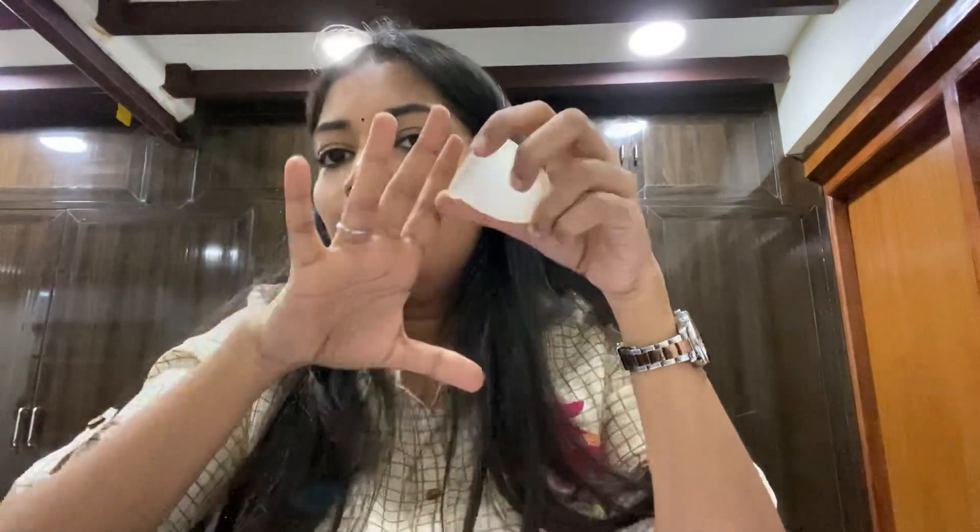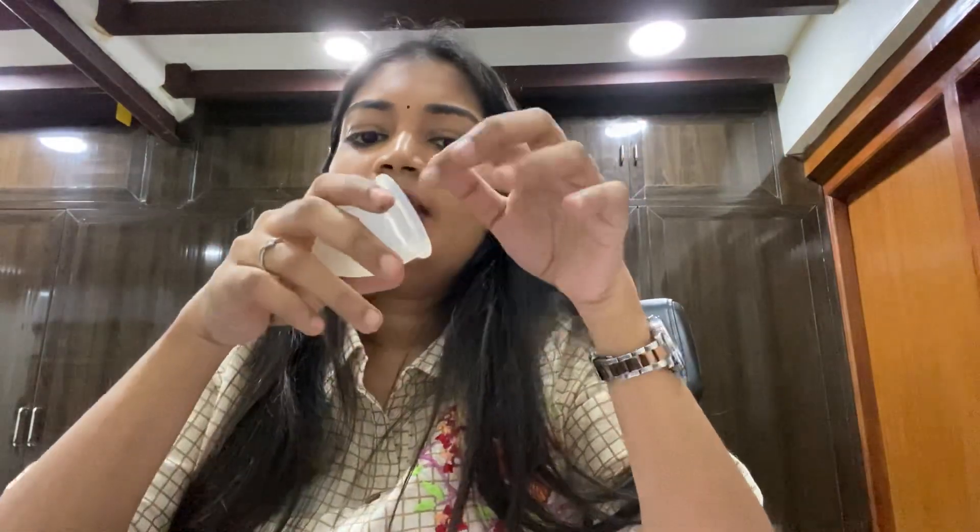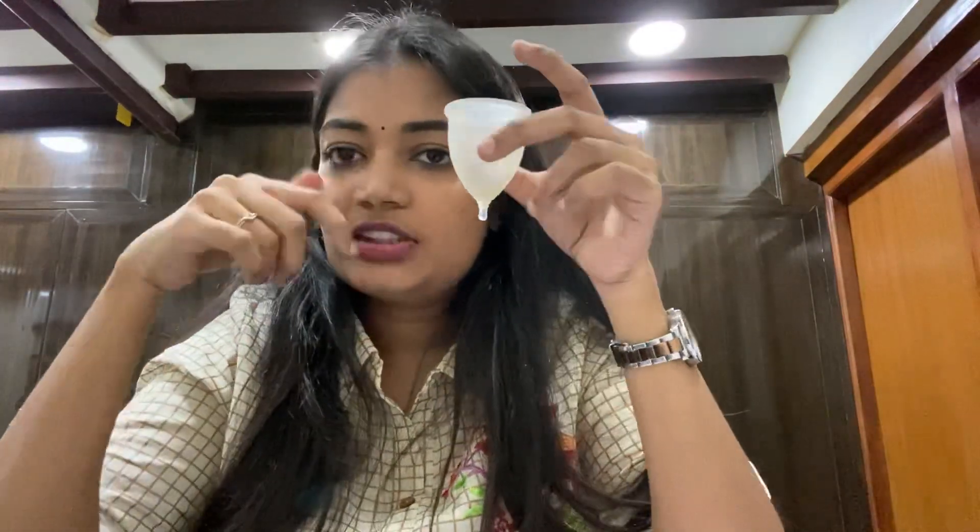Menstrual cups come in different sizes. There are small, medium, and large sizes available.